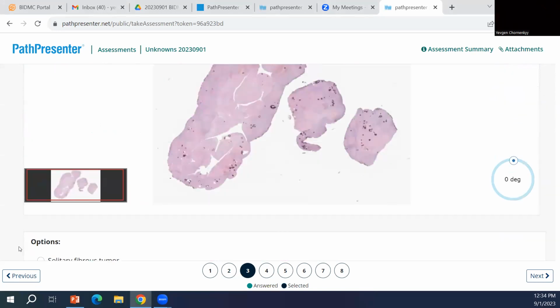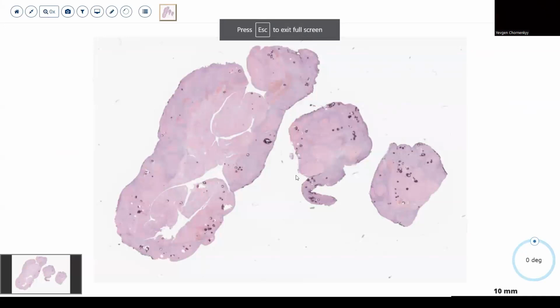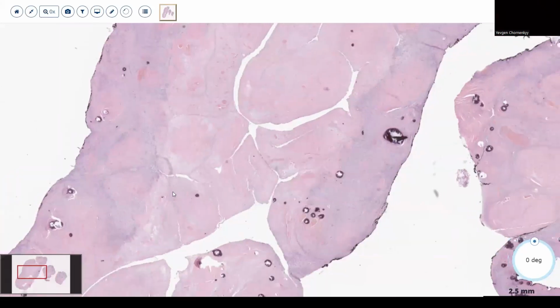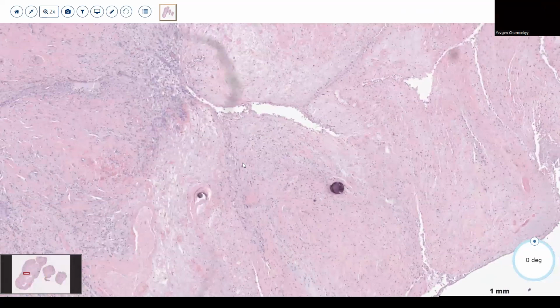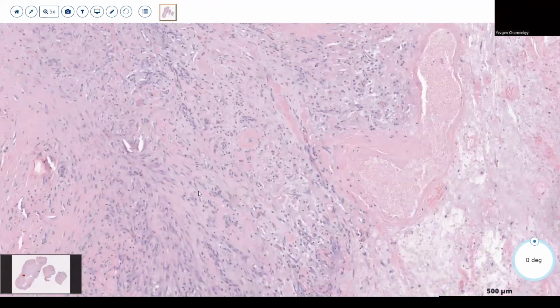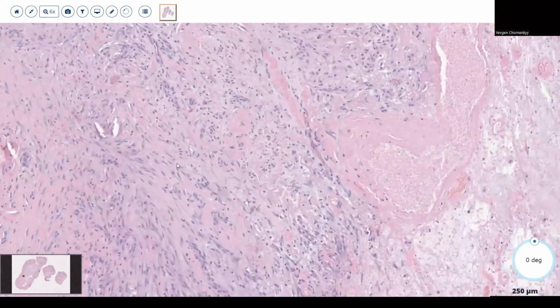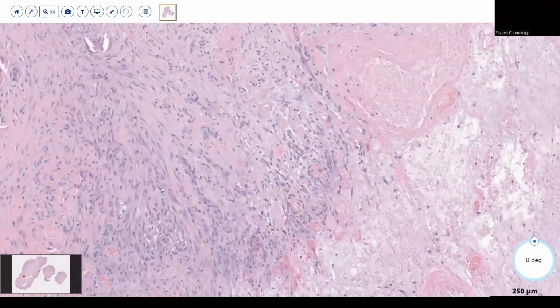So this is kind of the GI and bone and soft tissue crossover. So this was the mass. Anybody want to say, when you're looking at this right away, is it malignant appearing or more bland appearing? Just from this histology. It's in liver, architecture seems destroyed. No, it's not liver. He's tricking you. It's a mass around the abdomen, appendix area. But when you're looking at this, does this make you think it's malignant?